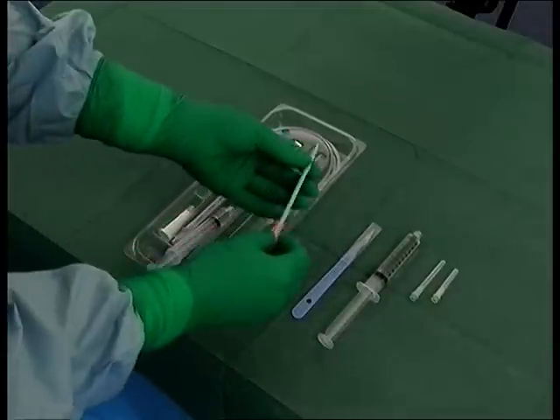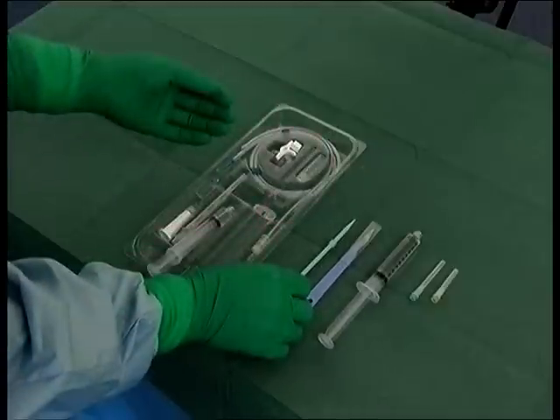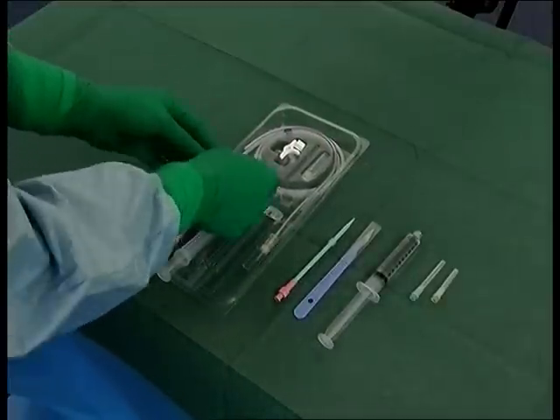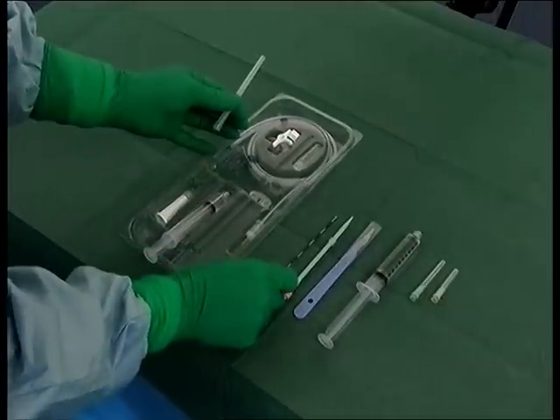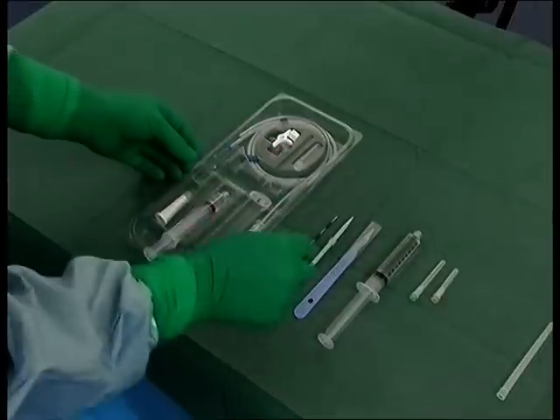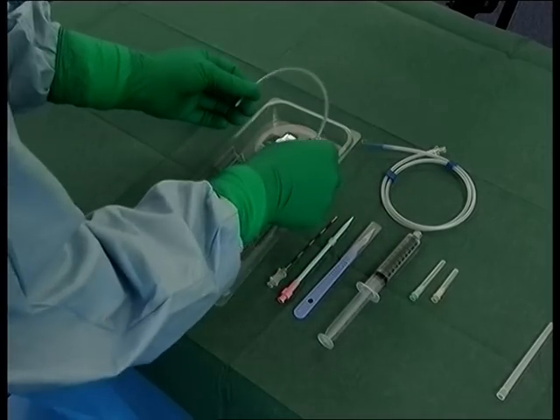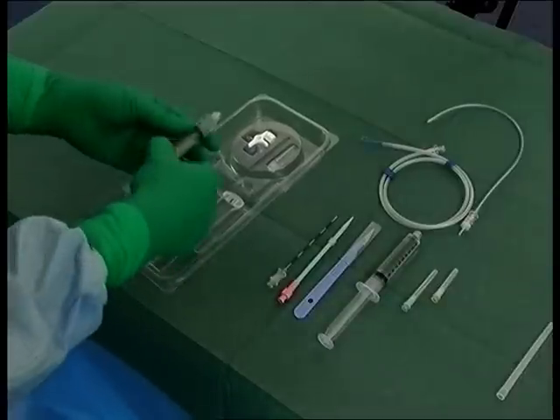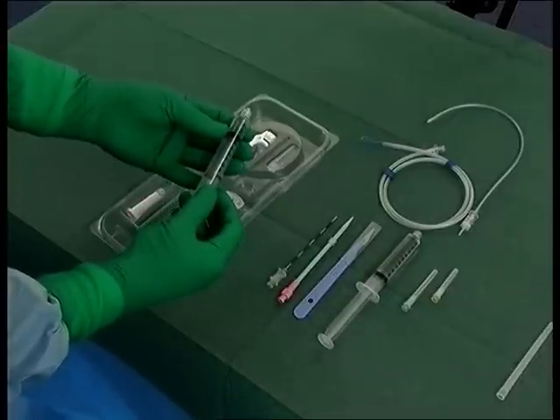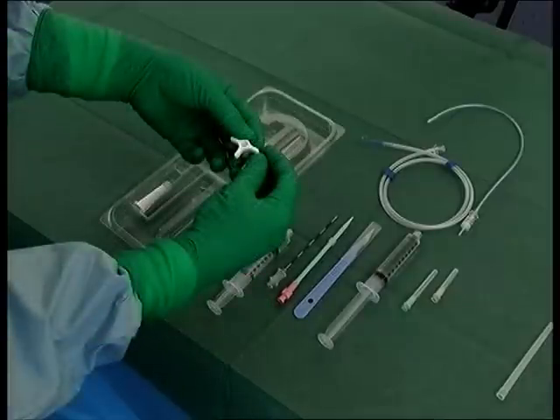a 10 cm dilator with adjustable safety stop set at 3.5 cm, a guide wire insertion needle with 1 cm markings, a stainless steel guide wire with introducer to straighten the tip, a chest drainage catheter, a 10 ml syringe loaded with 3 ml of local anesthetic agent, a 3-way stopcock with cap, a funnel and fir tree tubing connectors.